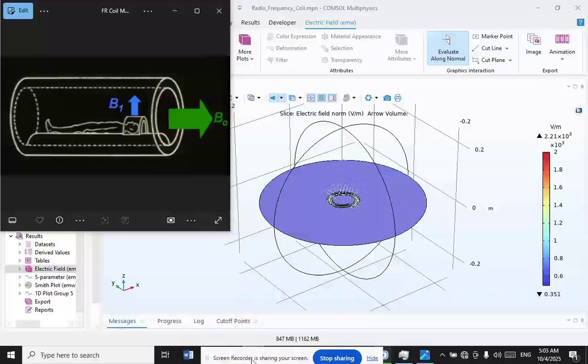The next one is surface coils. Surface coils are designed to provide a very high RF sensitivity over a small region of interest. These coils are often single or multi-turn loops which are placed directly over the anatomy of interest. The size of these coils can be optimized for the specific region of interest.